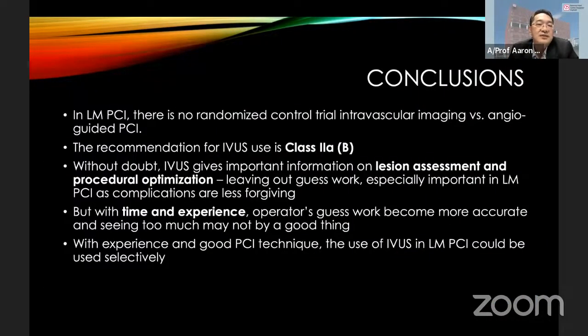So in conclusion, in left main PCI, there is no randomized trial. The recommendation of IVUS use in left main PCI is a class 2A, although registry data did show good outcomes, better outcomes with the IVUS, but we've been wrong before.